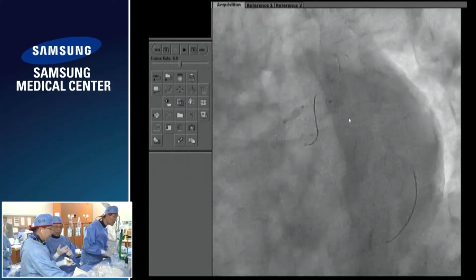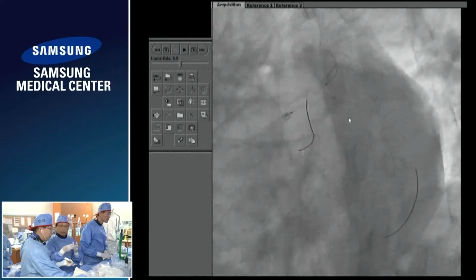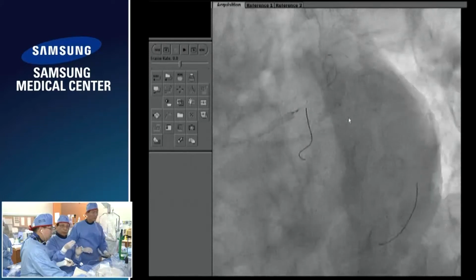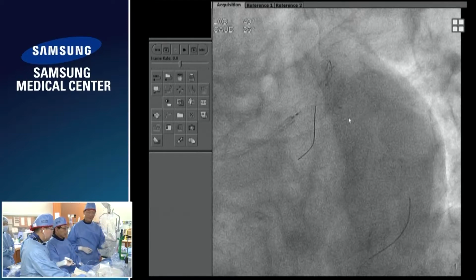So with this technique, this is easier, number one. Number two, we can avoid having too much of BRS struts protruding into the left main. Sometimes a 3.5 pre-dilatation balloon cannot cross the circumflex, but if I put the balloon in the LAD, it's kind of a little bit of an anchor for the circumflex. So I was successful for this case. Yes, yes.